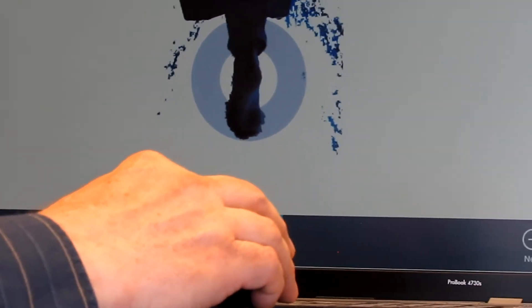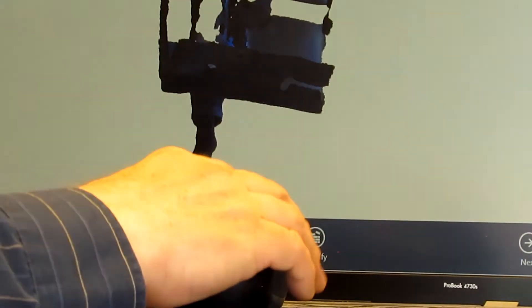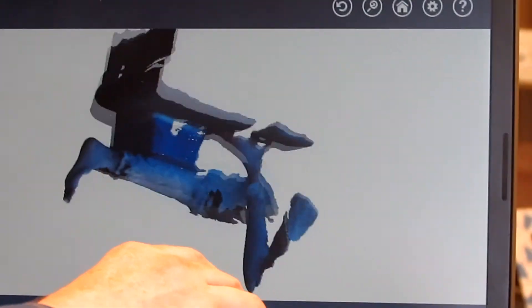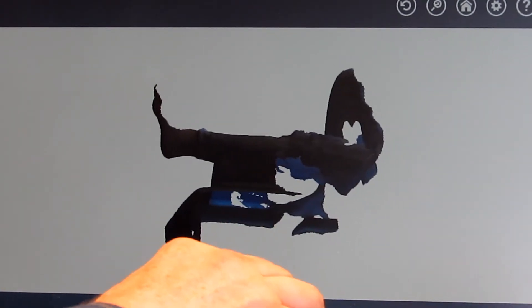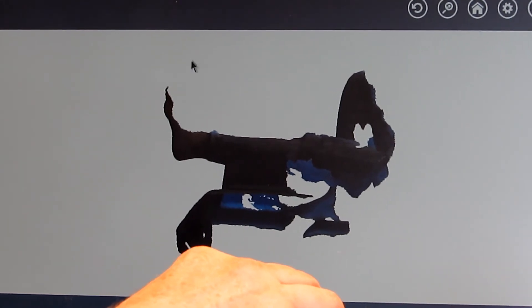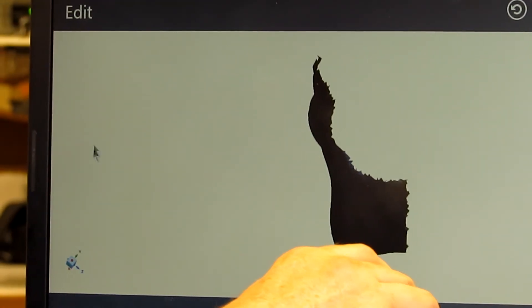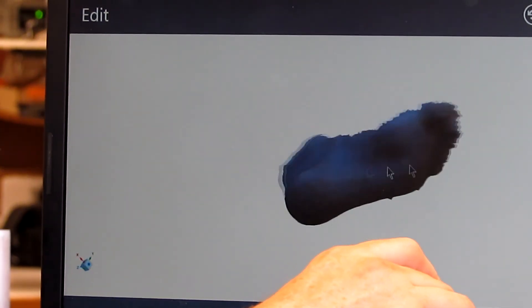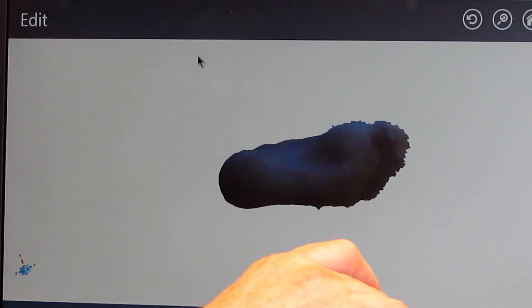Mr. Arch now hits the enter key on the computer. The computer captures the picture, processes the scan, and now we have the option of cropping out the foot and moving it around in any direction to give ourselves the time and measurements we need to make the most precise orthotic design, customized for your patient's foot. The foot can be moved in any direction — up, down, around — and we now have your patient's foot in our hands to give you the custom orthotic device.